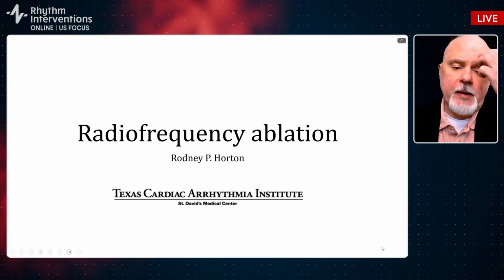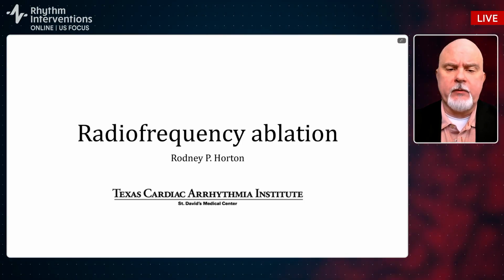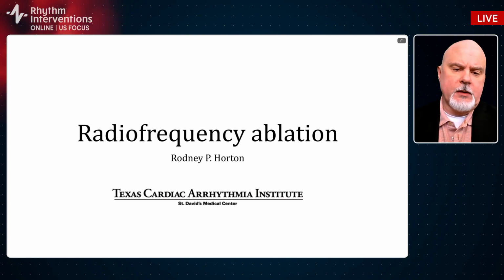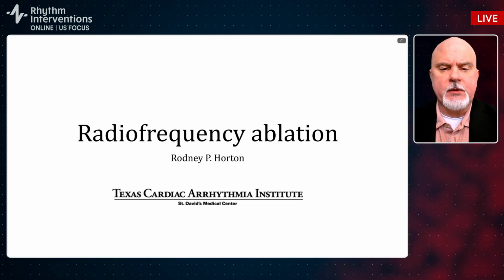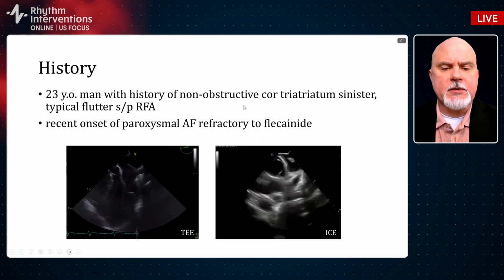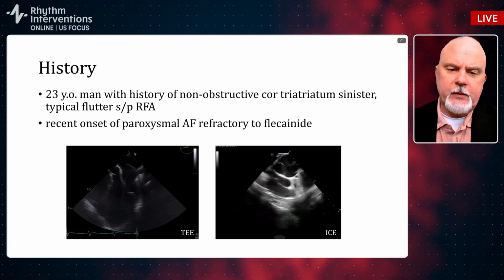I was asked to talk about mainly the workflow for using radiofrequency and specifically the Qdot ablation catheter for mapping and ablating atrial fibrillation. The case that I'm presenting is a 23-year-old gentleman. It's a bit unusual, but the workflow doesn't really change.